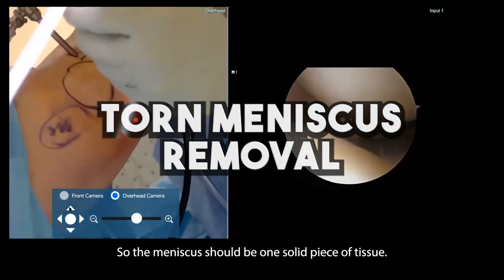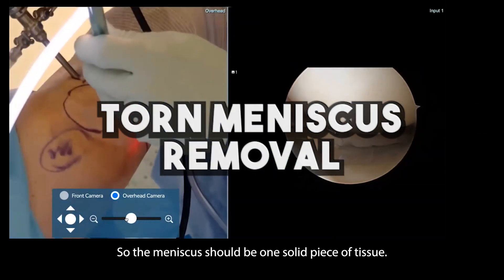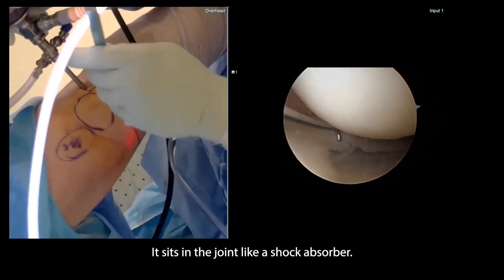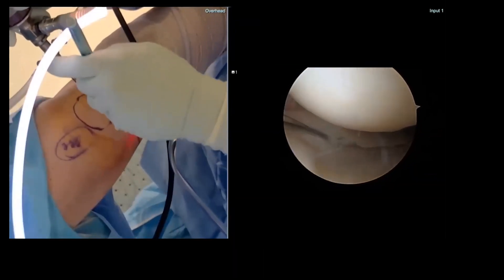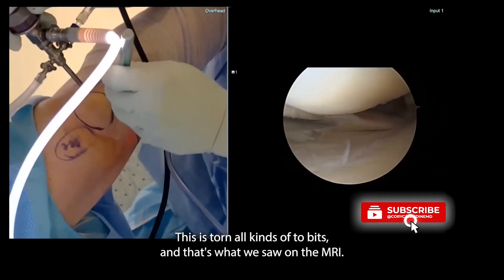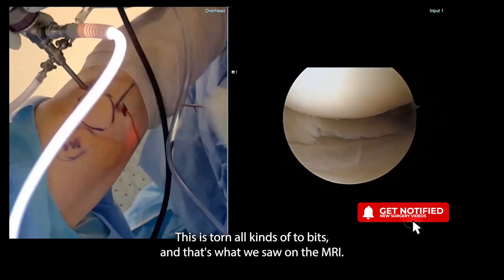This is the meniscus. The meniscus should be one solid piece of tissue — kind of like a marshmallow. It sits into the joint and acts like a shock absorber. But you can see this is not one piece; this is torn all kinds of ways, and that's what we saw on the MRI.